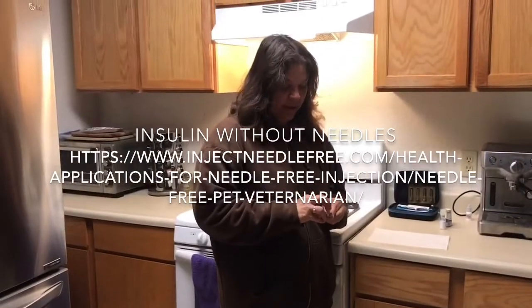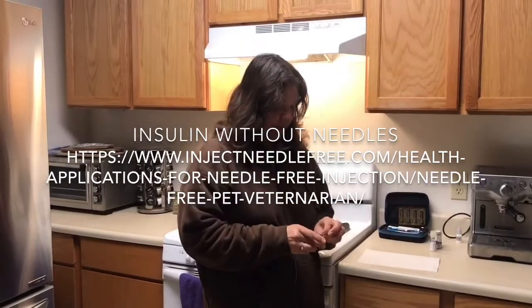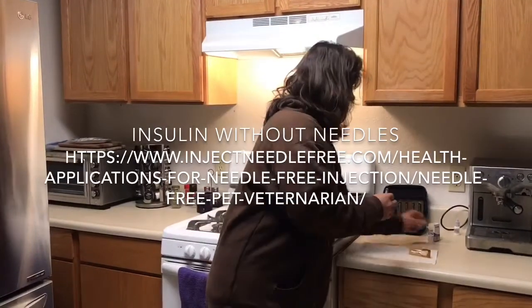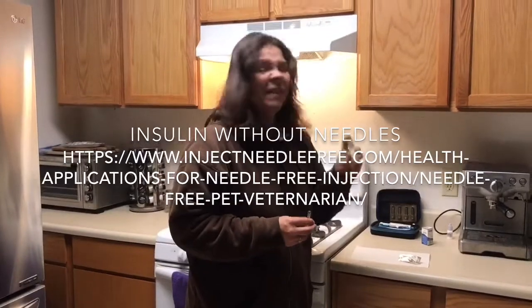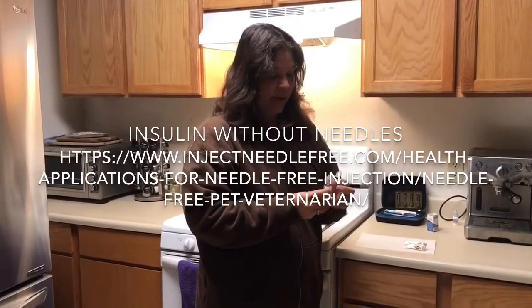Comfort in needleless injector. I have a severe needle phobia, so when our dog was diagnosed with diabetes it was an extremely huge challenge. When I found this, it has made our life a whole lot easier. We've been using it for about a year and a half now.